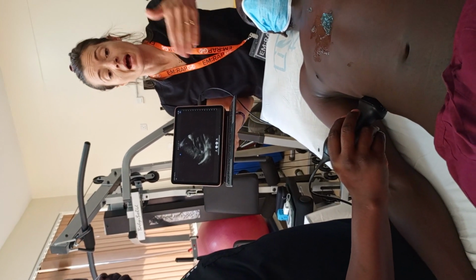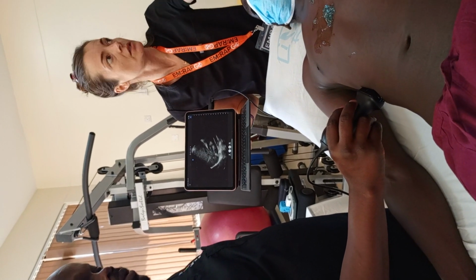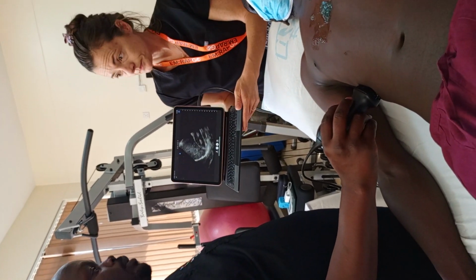Now, of course, if they have trauma to the chest, and I'm more concerned about chest trauma, I'm going to look at the subxiphoid first and take a look at their heart, make sure they don't have tamponade. But I typically start with the right upper quadrant.